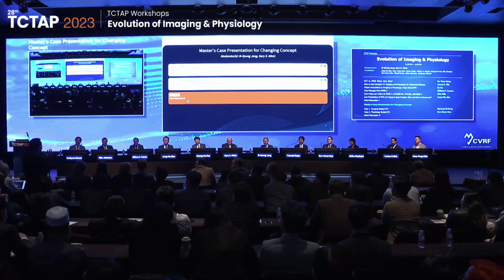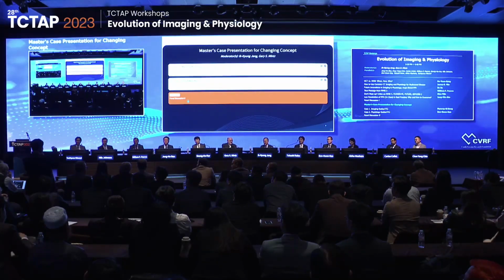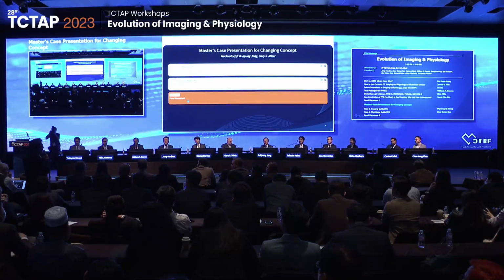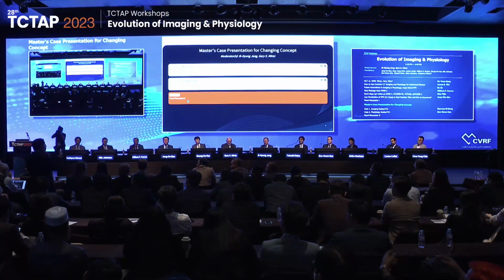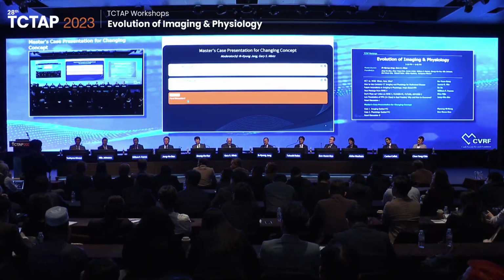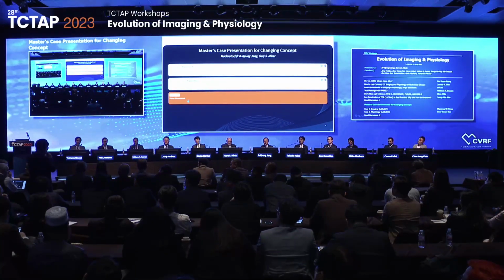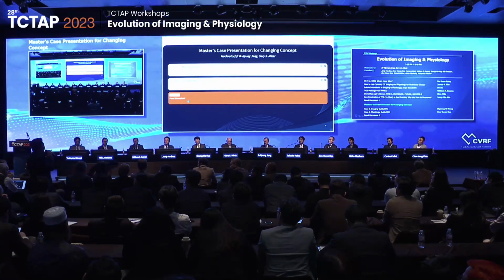On Dr. Koo's FLAVOR study, we have to know that IVUS minimal lumen area actually cannot predict FFR, though focal, localized left main disease is another story. In epicardial arteries, lots of factors influence the FFR, so minimal lumen area absolutely cannot predict FFR. However, in your study you compared IVUS-guided PCI with FFR-guided PCI, and I agree with that point.